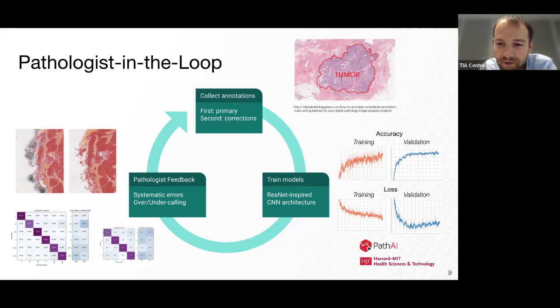There's just one other question from the chat from Craig Miles, who's asked, what zoom level were these patches extracted at? I'm assuming this is for training the CNNs. So I think there were both 20x and 40x. And, I'm not 100% confident on this, but I think we ended up just training with either 20 or 40. Okay, brilliant, thank you.